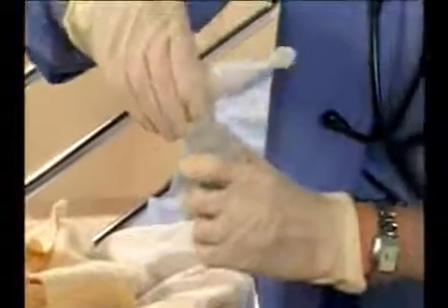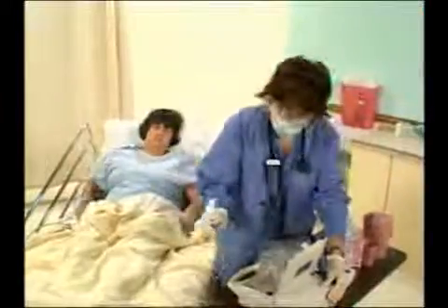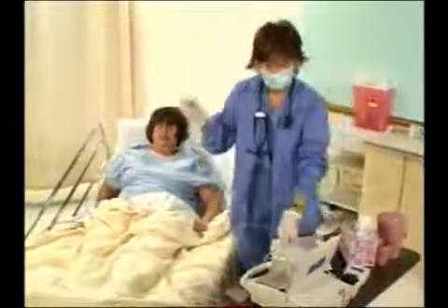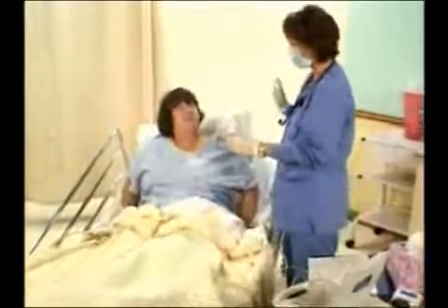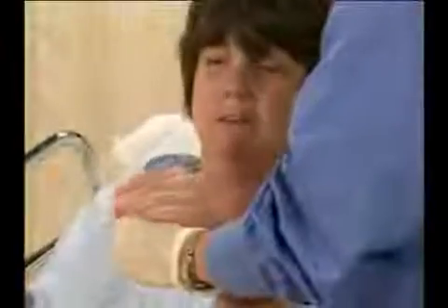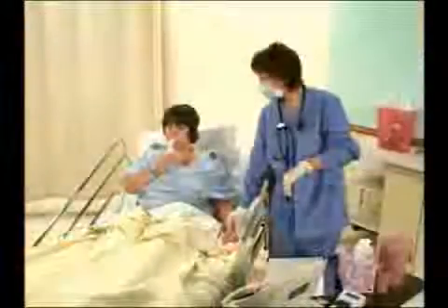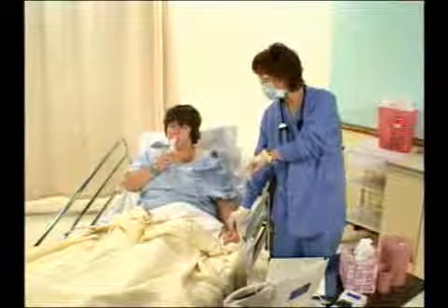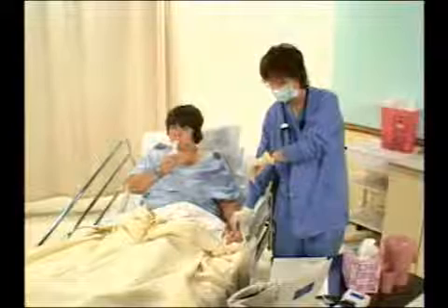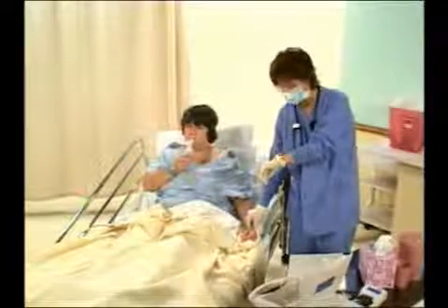Fasten the T-piece to the top of the cap. Always avoid touching the nebulizer mouthpiece or the interior part of the mask. Before turning it on, adjust to 6 liters per minute or less per the physician's orders. This drives the medication into a mist or wet aerosol form. Administer the entire dose of medication. This usually takes about 10 minutes. The medication is completely administered when there is no more mist being produced.